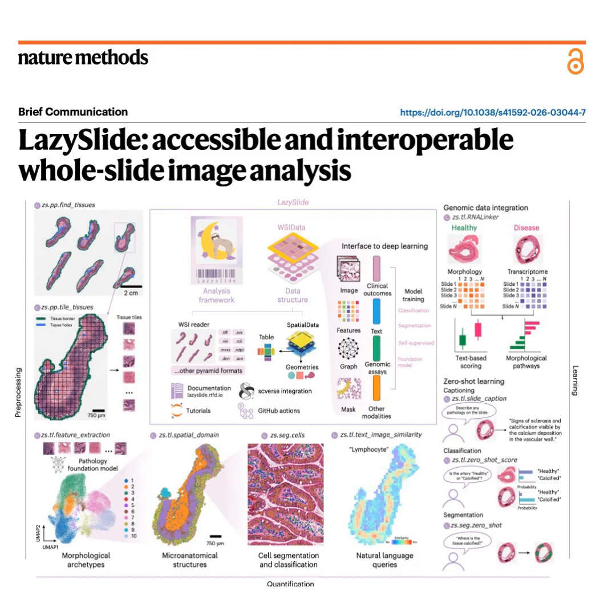Totally. So we have this system that can access 1 billion pixels without crashing the server, but simply accessing the image doesn't mean the computer actually knows what it's looking at. Right. A bunch of pixels is just noise until you give it structure. Yeah. That brings us to the actual image processing pipeline. How does LazySlide actually read the slide? Because it has to separate the actual biological tissue from the bright white background of the glass slide, right?